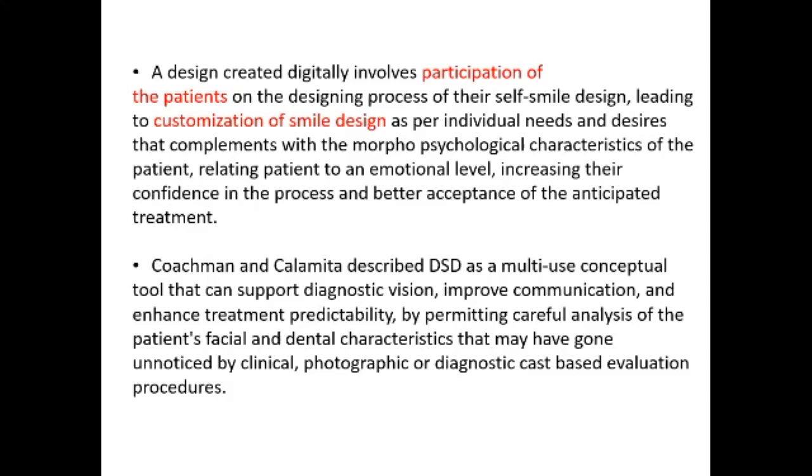Coachman and Calamita described DSD as a multi-use conceptual tool that can support diagnostic vision, improve communication, and enhance treatment predictability by permitting careful analysis of the patient's facial and dental characteristics that may have gone unnoticed by clinical, photographic, or diagnostic cast-based evaluation procedures.